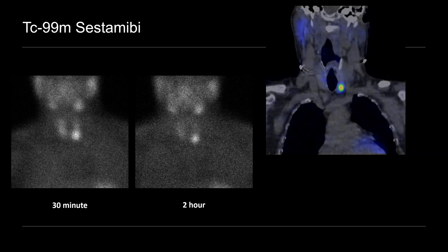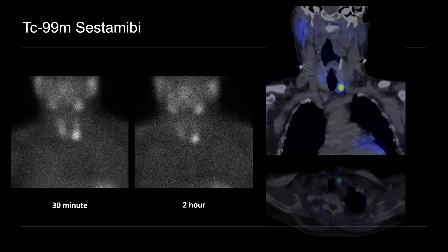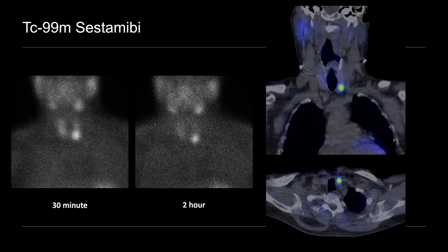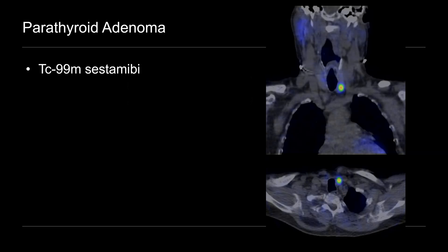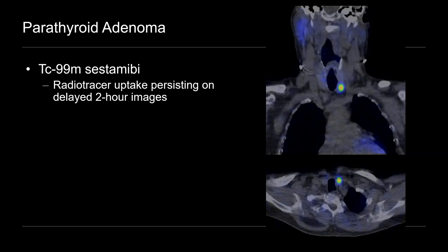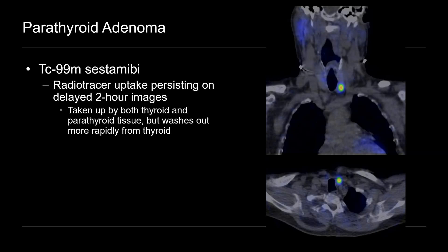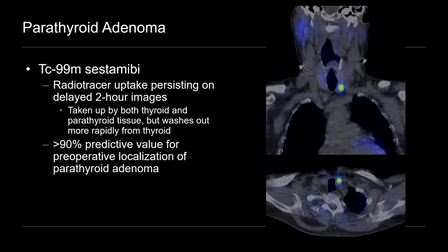This is better localized on the SPECT CT images, where the nuclear medicine images are overlaid onto a CT. You can see marked avidity at the lower pole of the thyroid on coronal imaging, and also on the axial image. These scans are very helpful for localization — there will be radiotracer uptake that persists within a parathyroid adenoma on two-hour delayed images. Sestamibi is initially taken up by both thyroid and parathyroid tissue but washes out more rapidly from the thyroid. There is a greater than 90% positive predictive value for preoperative localization of parathyroid adenomas, and SPECT CT can further aid with anatomic localization.